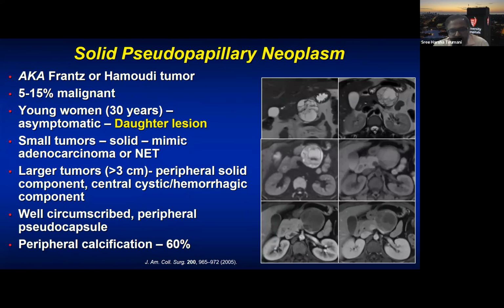The classic hallmark is that they are usually large tumors with a lot of heterogeneous internal components, with hemorrhage, as in this case, this is a T1 weighted image, which shows high signal. So this is hemorrhagic or proteinaceous material. And posteriorly, if you see on both the T2 weighted and the post-contrast images, there is some heterogeneous T2 high signal, like septations, but on post-contrast, it has more solid enhancement. So when you have this kind of appearance in a young patient, it's almost a given that this is a SPEN, or a solid pseudopapillary neoplasm.